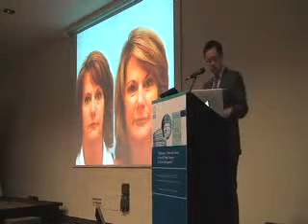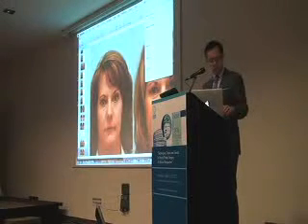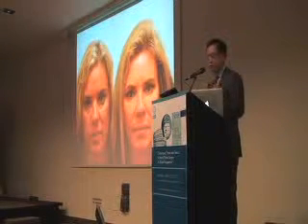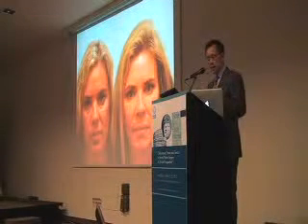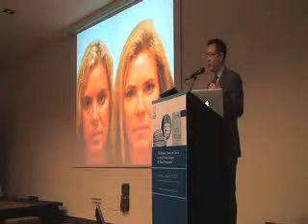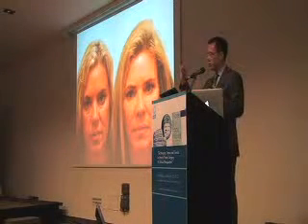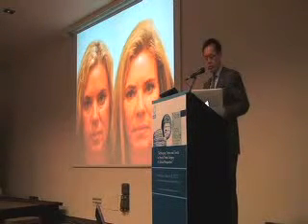Okay, sorry, let me go back one. Okay, so this is an upper blepharoplasty combination with resurfacing, I did a plasma skin resurfacing and fat transfer. And I think in this case, when you see some crepiness along the edge, when the skin hangs over the ciliary margin, a very conservative removal, we're talking about just a few millimeters of skin, is a good adjunctive procedure.